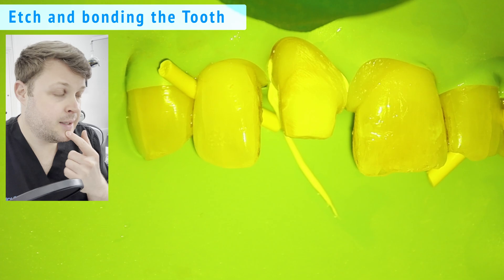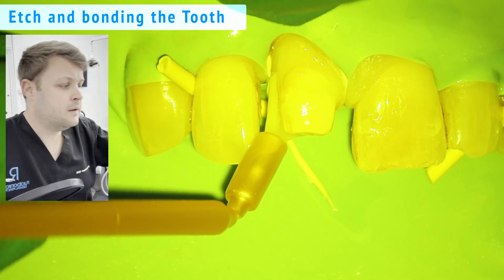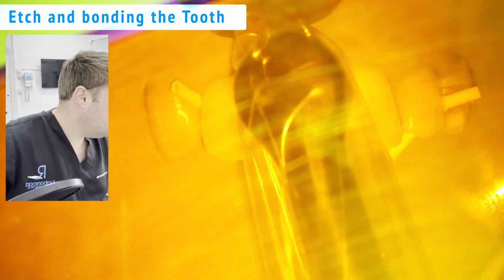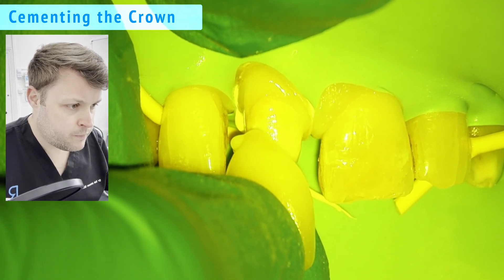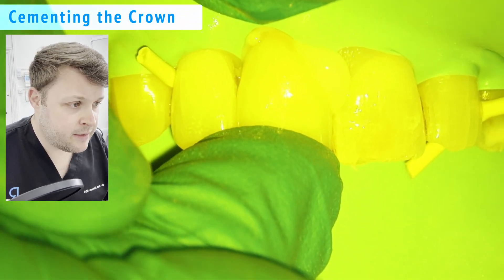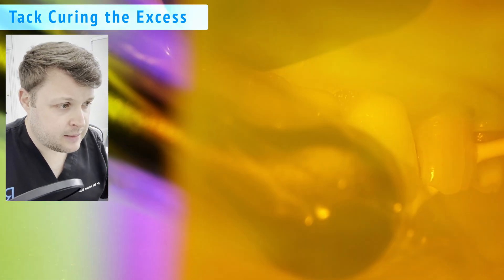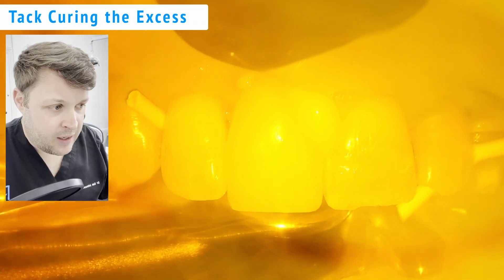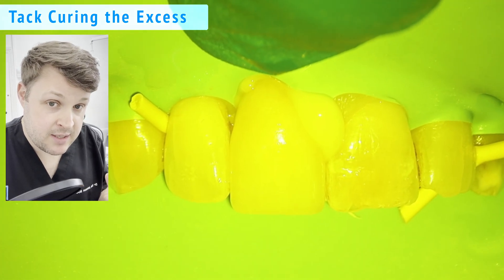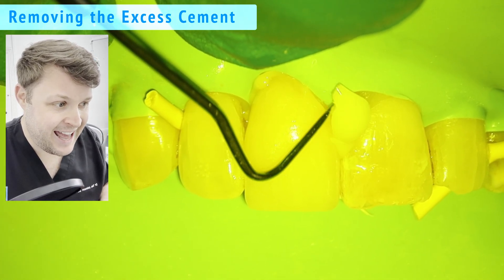The bond I'm using is i-Bond, and I'm cementing the crown with ReliX resin cement. Now I'm tack curing the resin cement — I don't want it to set completely, I just want it to harden enough so I can scrape any excess away.